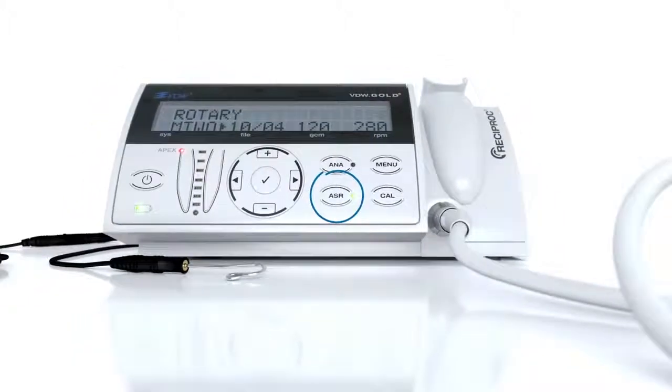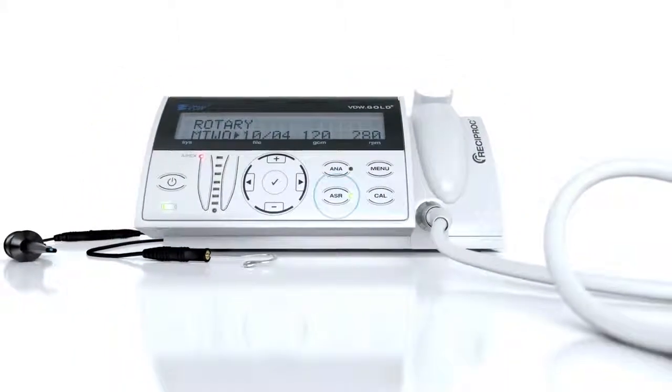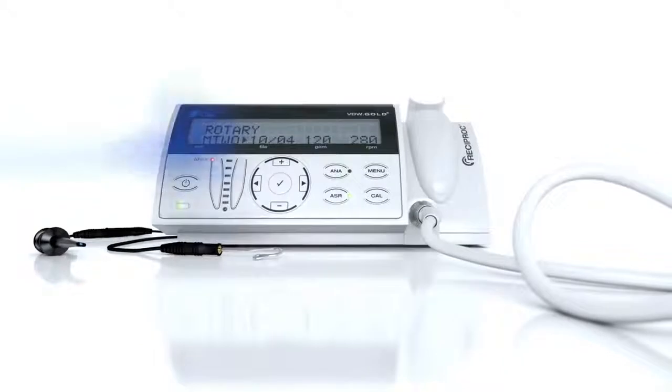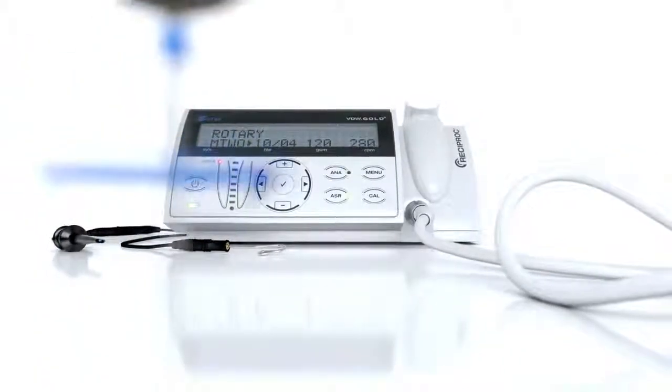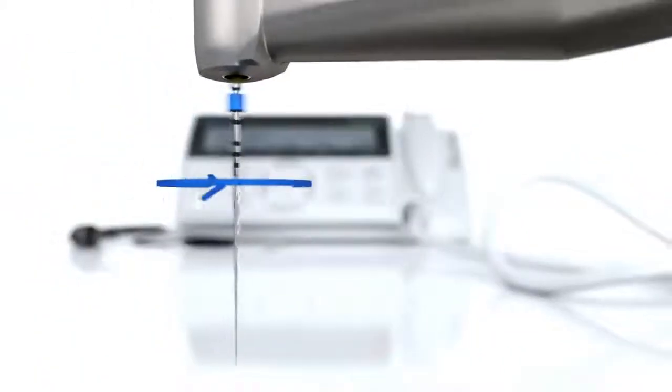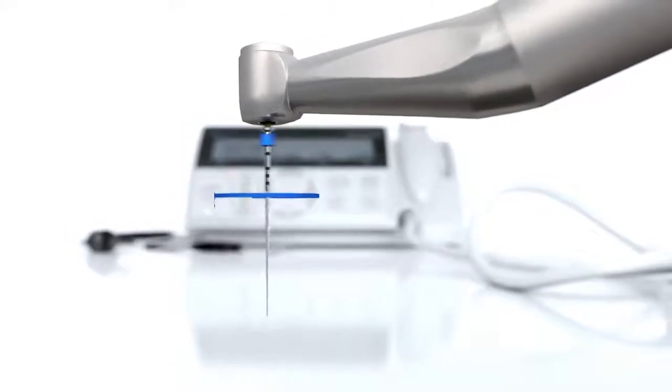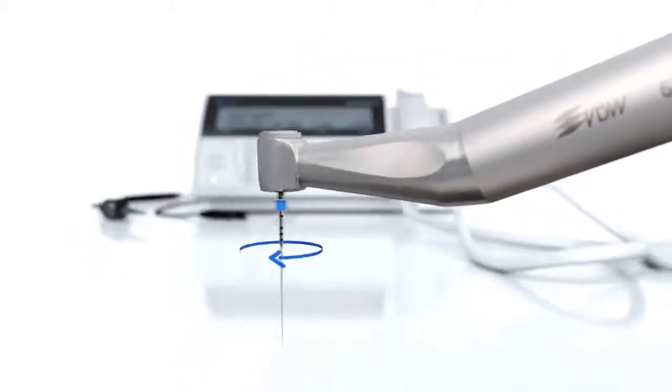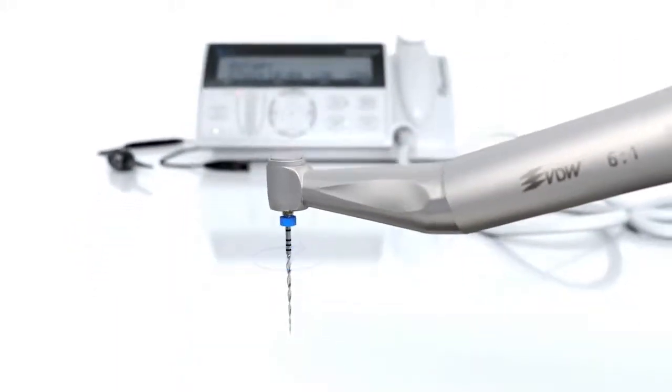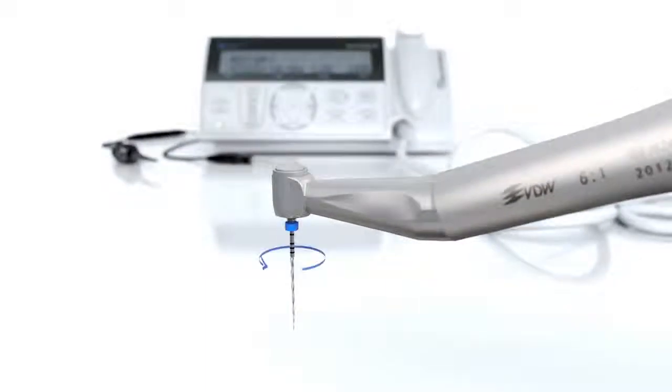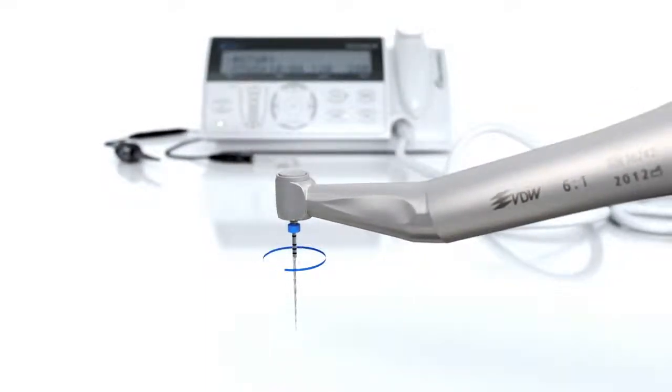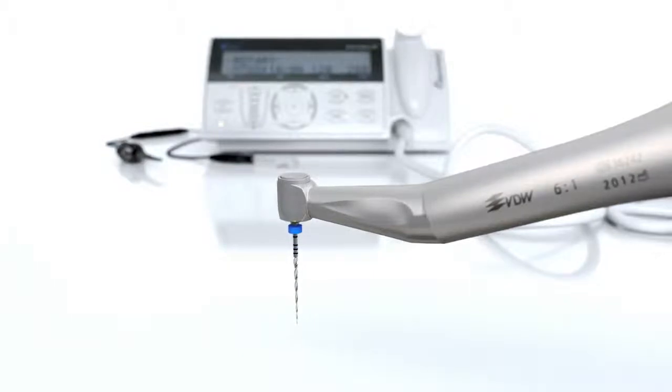Pressing the ASR key controls the auto stop reverse function. When the ASR key lights green, the torque level for each file size is monitored. When the preset torque limit is reached, the motor stops automatically and reverses into counterclockwise direction until the file has freed itself. Then the motor will revert back to clockwise rotation.